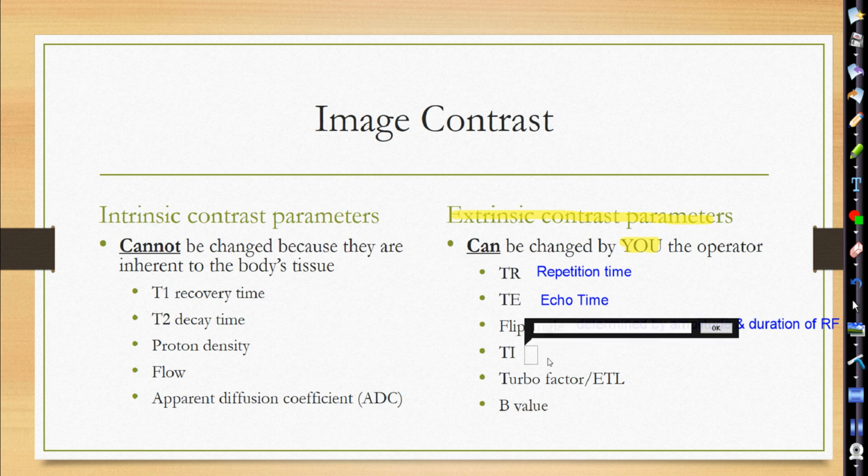Okay, what do we think TI stands for? I don't know if you guys ever talked about these things with the techs. This one's called inversion time.